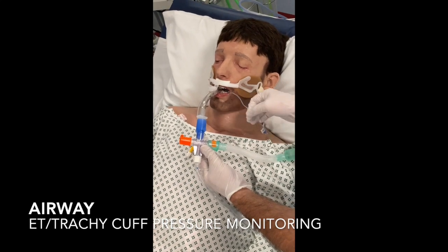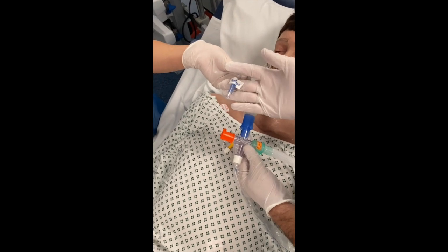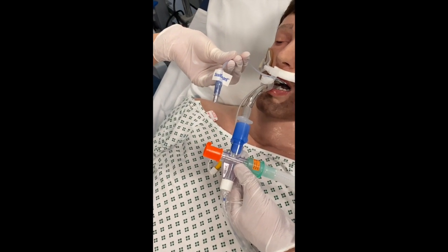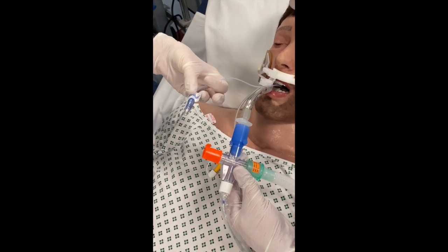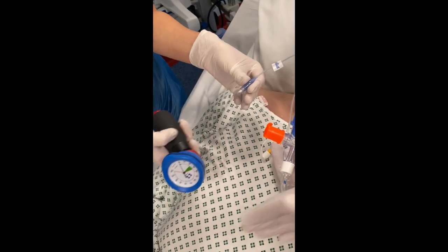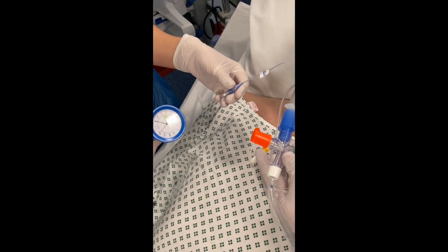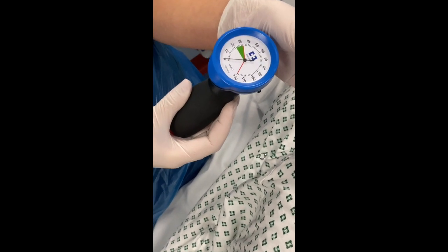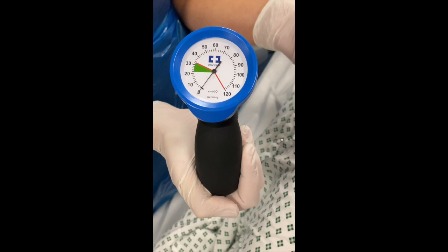So finally, we're going to look at how to ensure that the pressure in the cuff is adequate for maintaining that tight seal — avoiding any secretions to come down and get aspirated, any gastric content to come up, reflux and get aspirated into the lungs, but also to provide a tight seal that will allow mechanical ventilation to be effective.